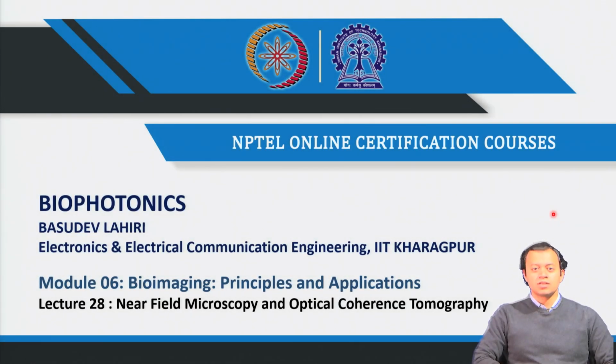In the last few classes, we discussed microscopy in general, and we also discussed the diffraction limit. Diffraction limit is the fundamental limit by which any optical instrument, any microscopic instrument, any telescopic instrument is bound. That is the minimum resolution, the minimum resolution that an optical instrument can resolve.